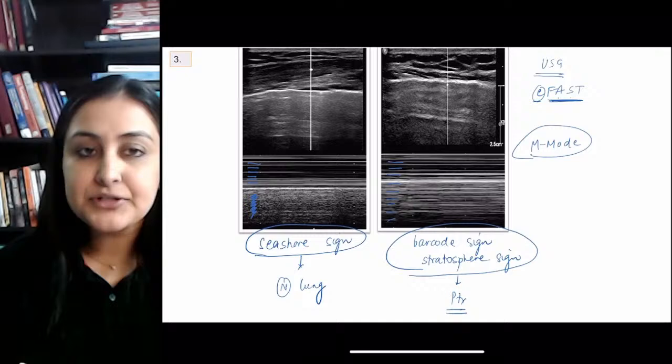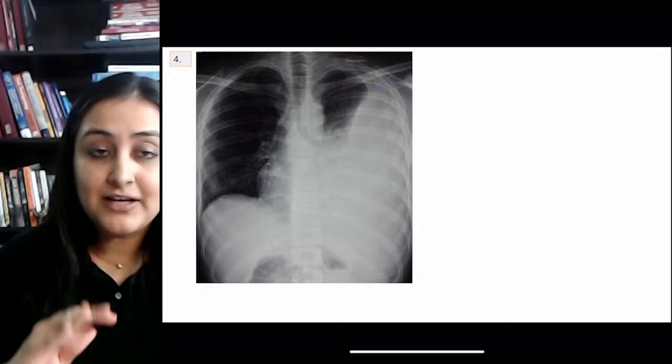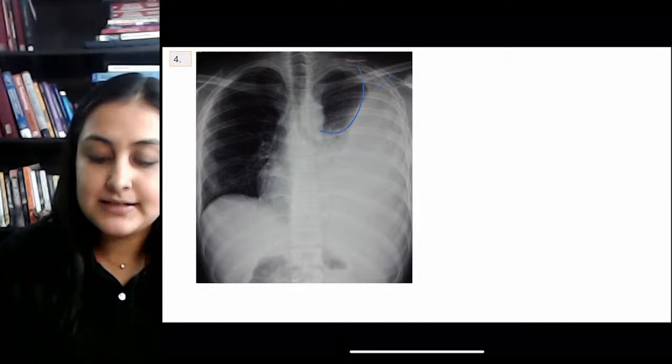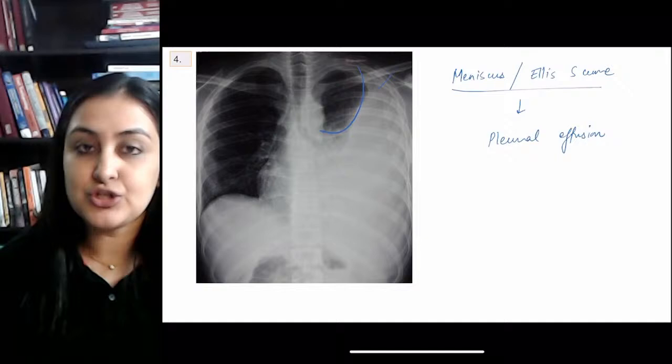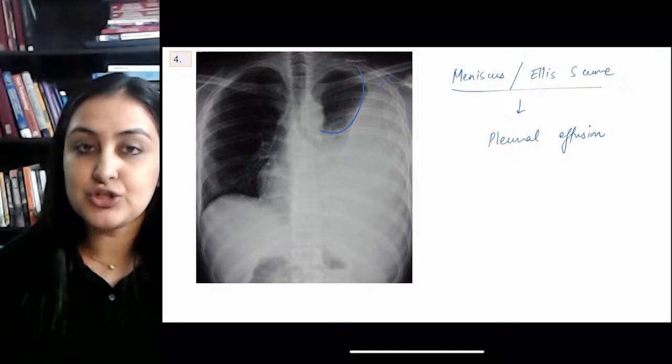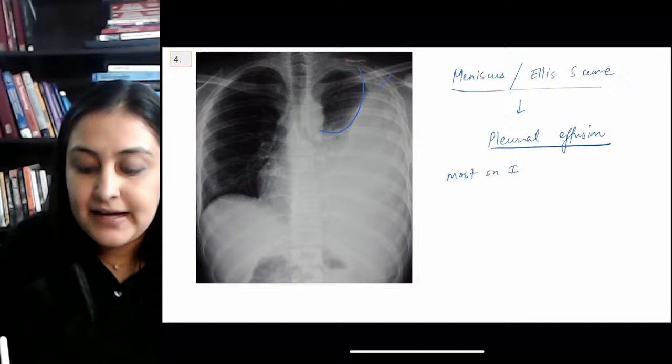Image 3: The abnormal side is the left, showing opacity with a meniscus — a curved shape — indicating fluid. This is the meniscus sign, also called the Ellis S-curve, seen in pleural effusion. If this is from trauma, call it hemothorax. For hydropneumothorax, you would see a flat air-fluid level, not this meniscus. The most sensitive investigation for any fluid — pleural effusion, pericardial effusion, ascites — is ultrasound.